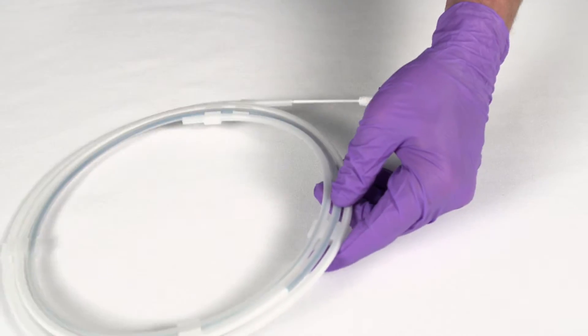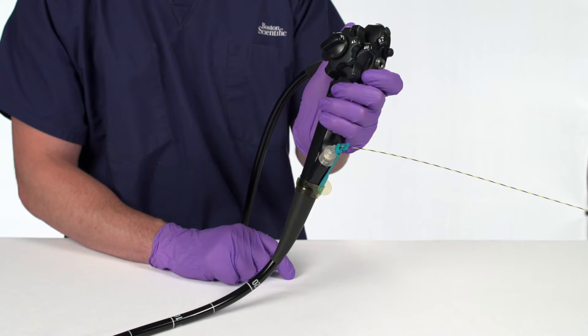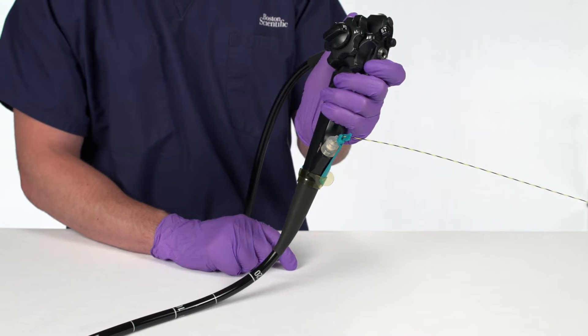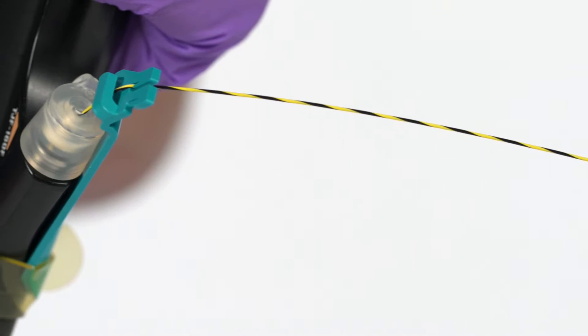Remove the products from the packaging. Confirm the guide wire placement above the stricture, stone, or injury fluoroscopically. Lock the guide wire into place using the Boston Scientific RX Locking Device.